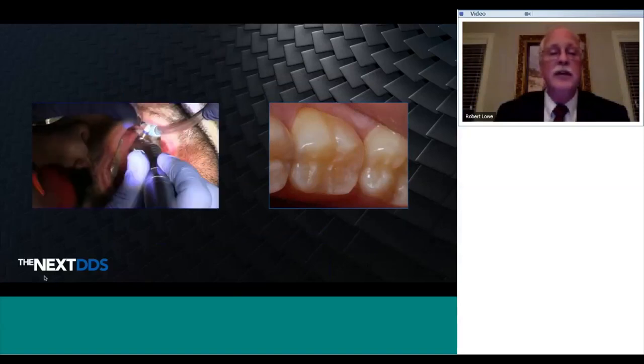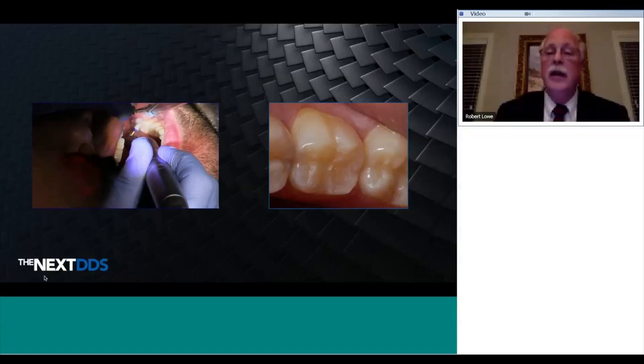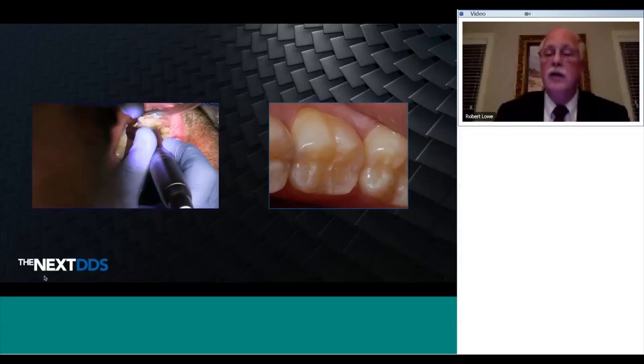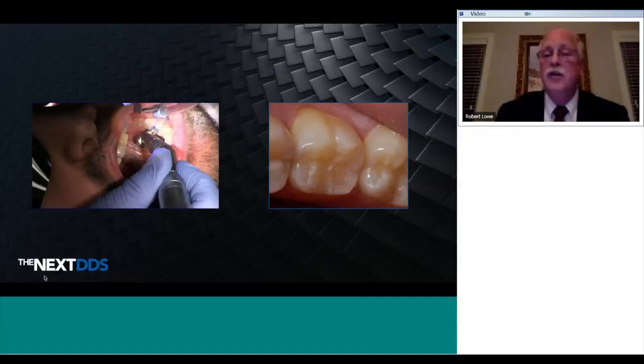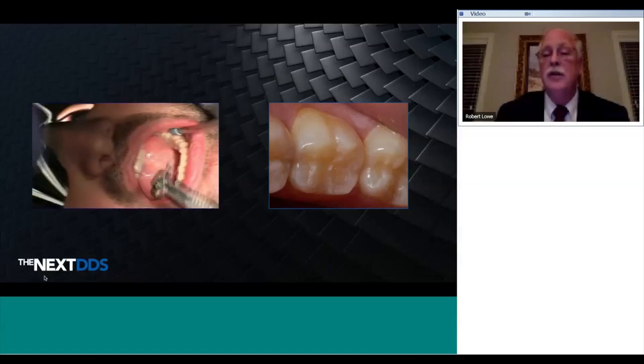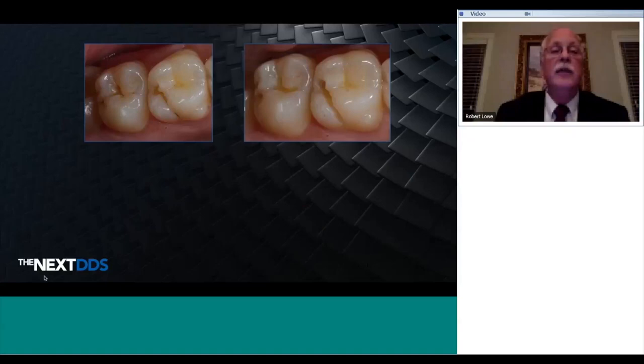Once the restorative material is placed and polished, you can see the tooth on the right is the restored tooth. My challenge to you is show me where the filling is. Show me where the restoration is. Conservative preparation because of early diagnosis, minimal preparation, and restoration. Here are two other examples.